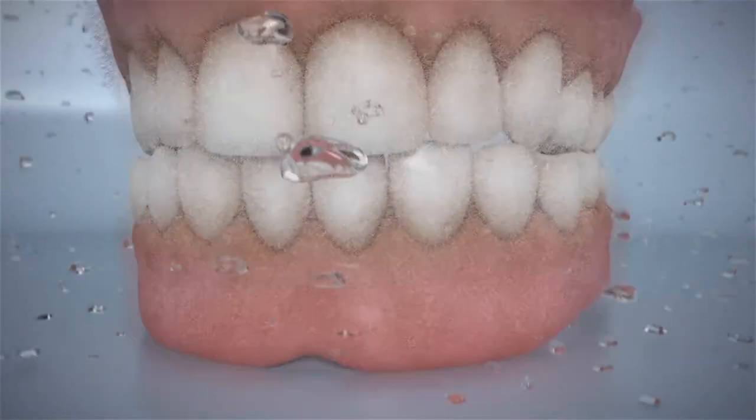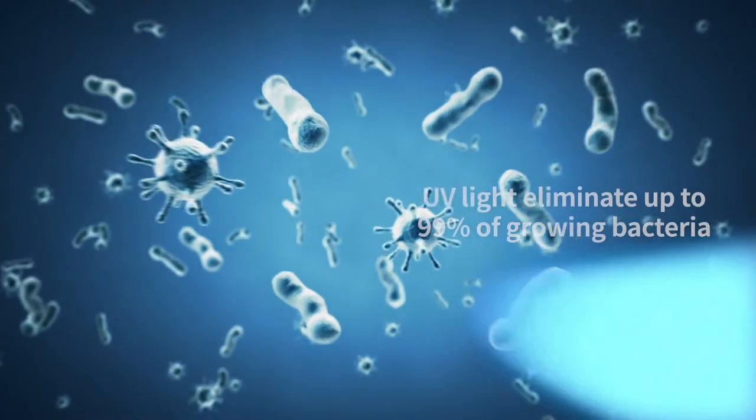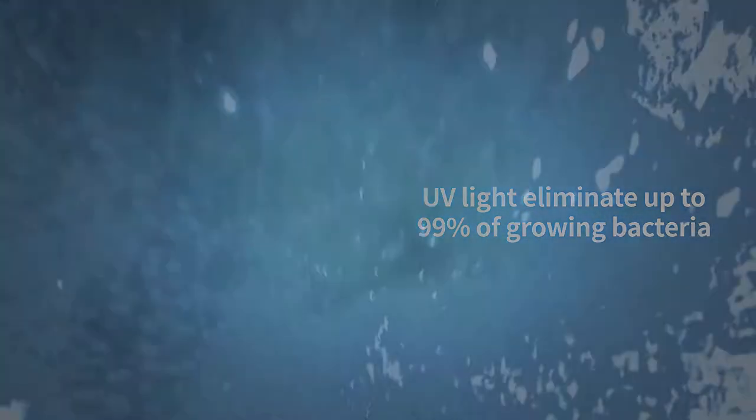The ultrasonic vibration cleans debris and plaque, while the UV lights disinfect, eliminating up to 99% of growing bacteria.